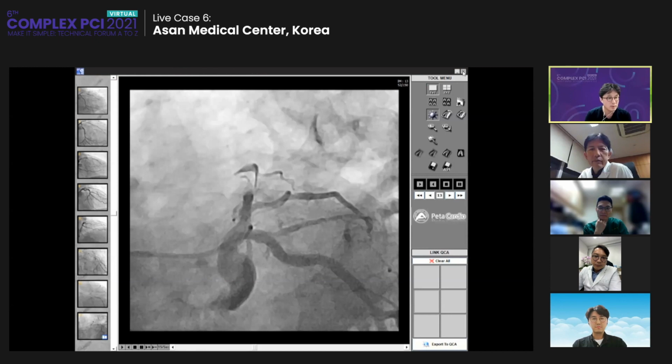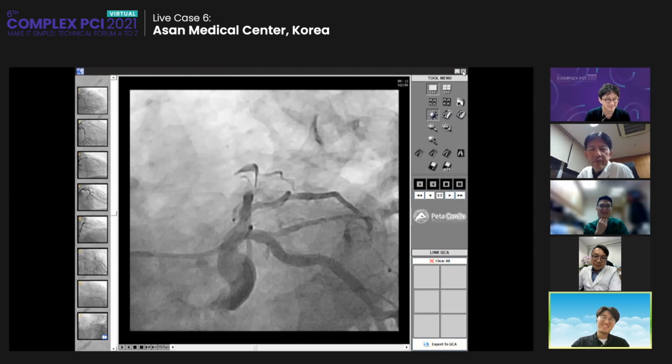Dr. Muramatsu, how about you? Is it a very easy case for you? No, I don't think so.